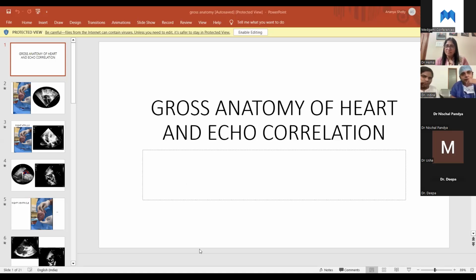And many times, especially when we see the interatrial septum, the interventricular septum, or the PAs, MAPCAs at different points, you have to use a lot of imagination, and over time we get used to where this VSD is, where that muscular VSD is, where the inlet is. So there definitely is a lot of difference from just a still image of an echo. Again, the moving image is so much better. That's why we always sit down together and see the echoes before we go in.